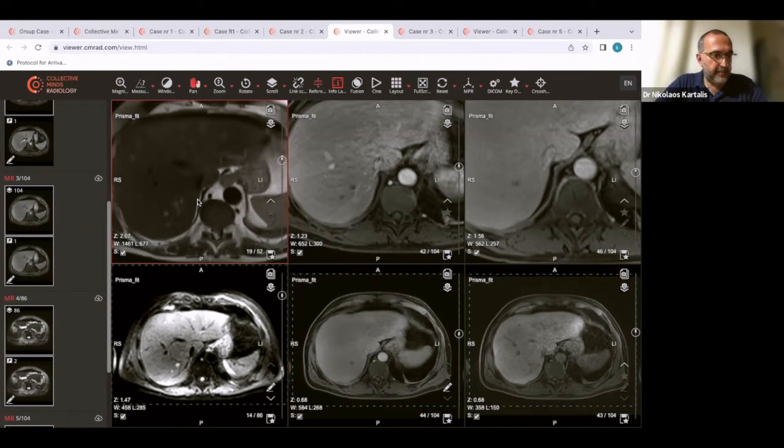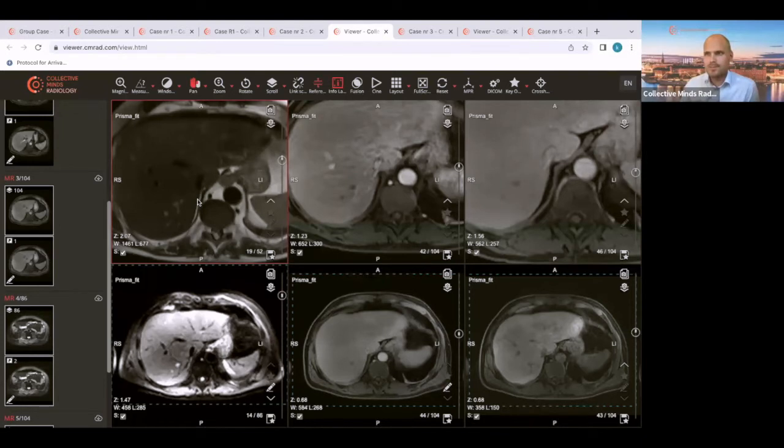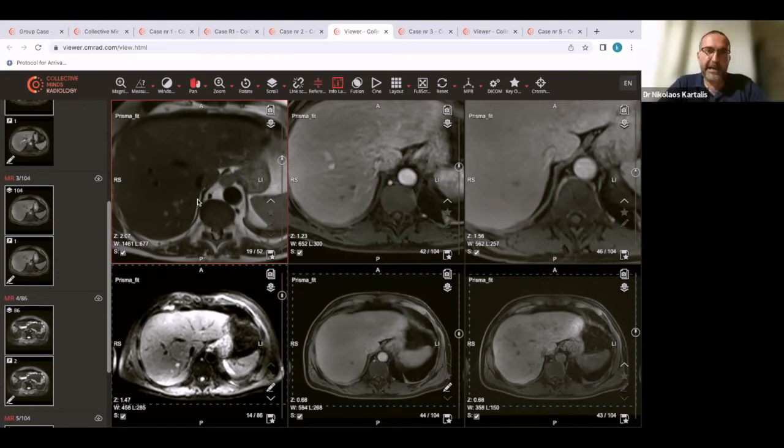So, Fredrik, can we ask the audience? Absolutely. So the poll is open. Question: what is the most likely diagnosis for these 2? These are images of the same pathology, the lesions have the same pathology. Are these hemangiomas? Are these 2 metastases, intrahepatic cholangiocarcinomas, or HCCs?